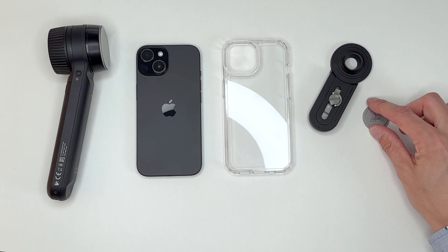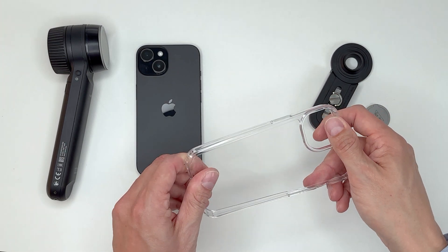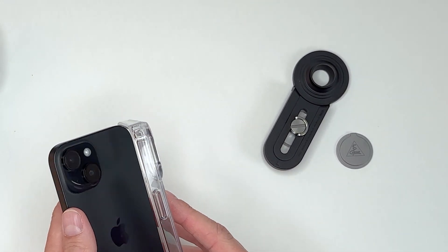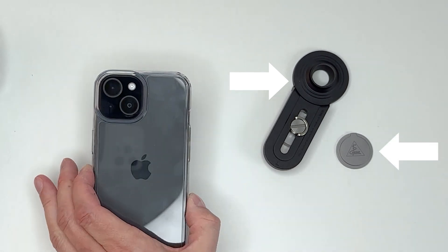We recommend using a smooth hardshell phone case to ensure optimum adhesion of the fixing button. The Universal Smartphone Adapter Mac consists of two parts: the handle with a magnetic button and a screw, and the fixing button.